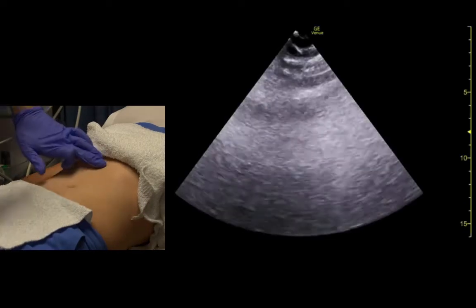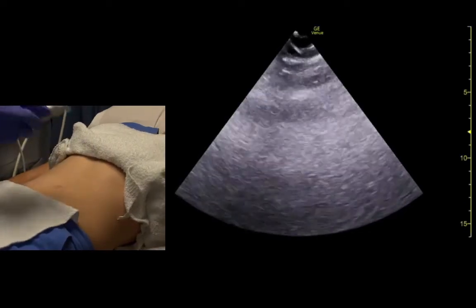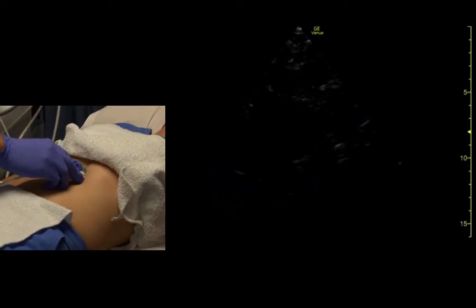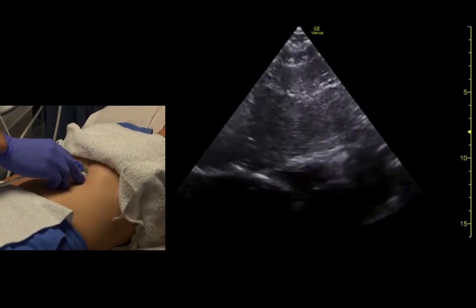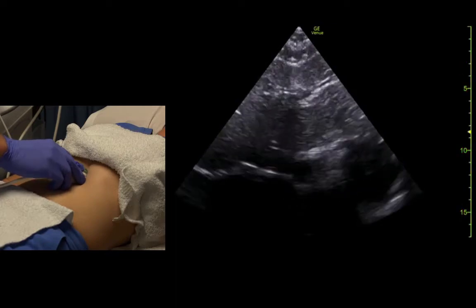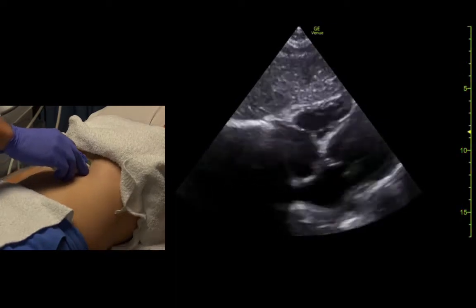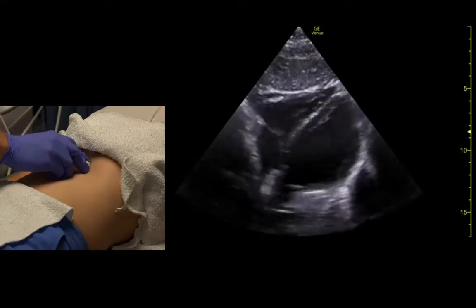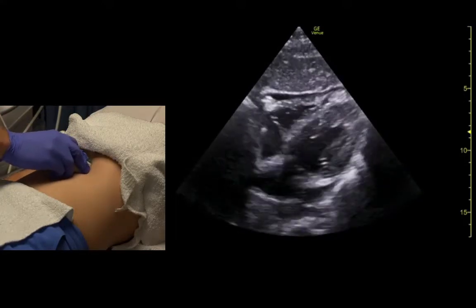Alright, let's do sub-xiphoid heart. So indicator is towards about 3 o'clock. We come under the xiphoid and we'll ask her for a big breath and hold. And we get a pretty good view of the heart here.